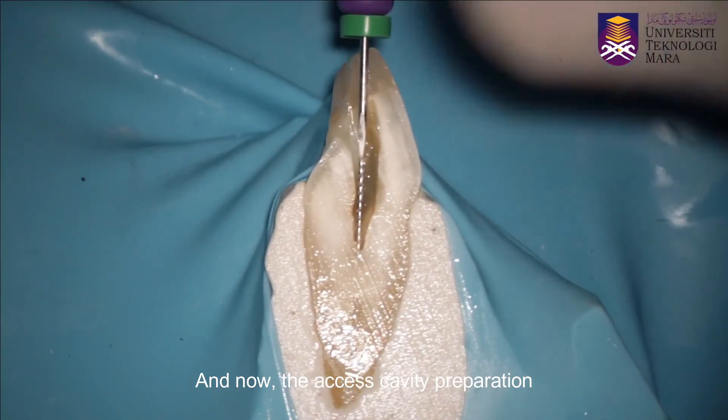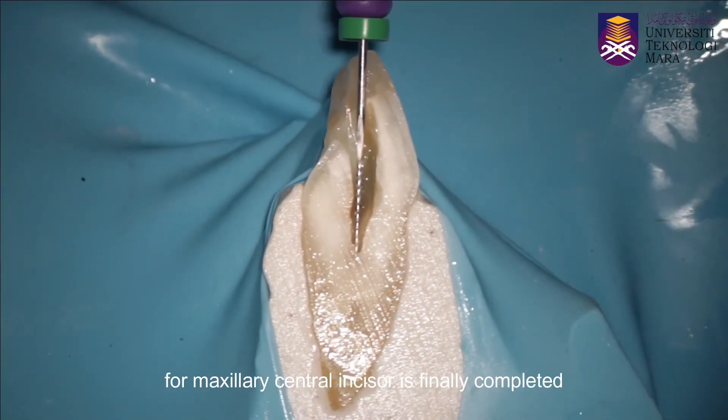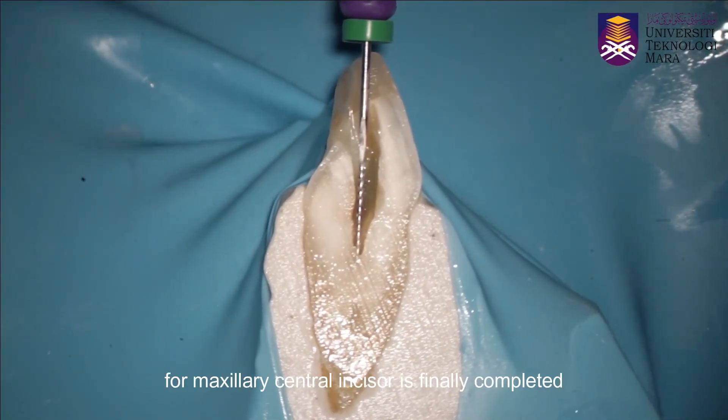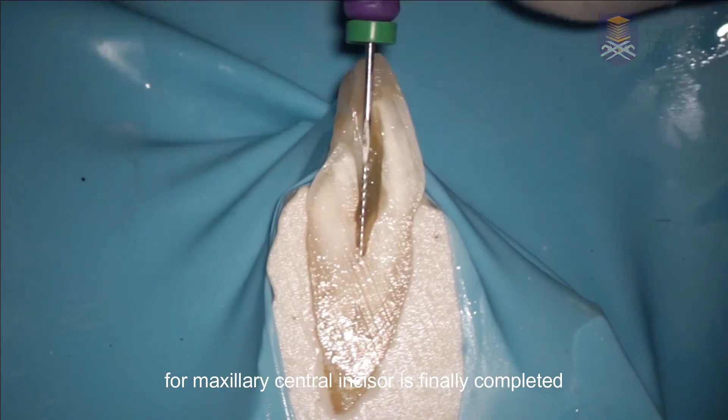The access cavity preparation for the maxillary central incisor is finally completed.